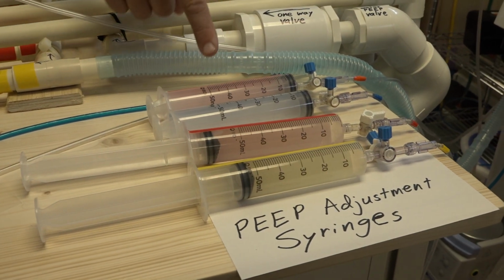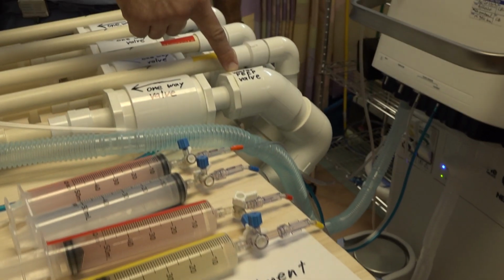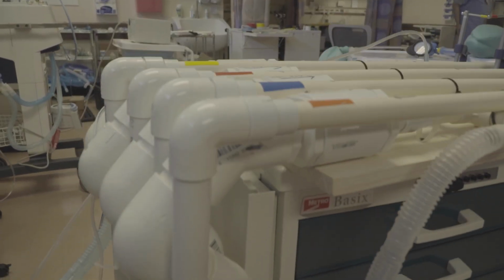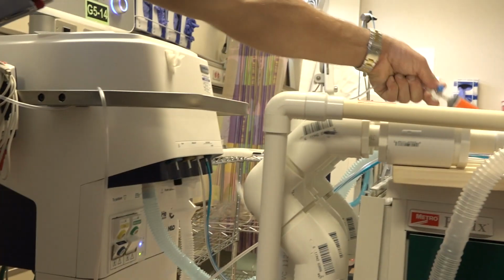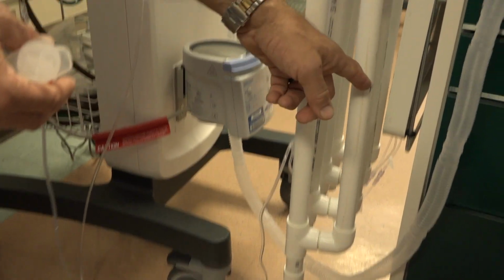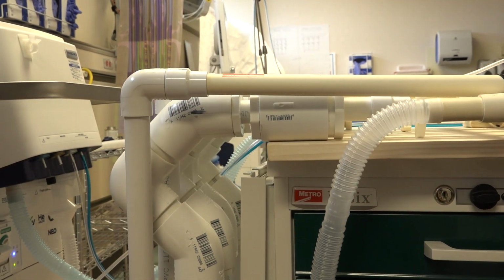So you'll notice we have some syringes here. They're different colors, indicating different patients. These syringes are then attached to our water PEEP valve located right here. And you can see over here, we have our expiratory flow going down this way, and water can be added with this syringe here to your desired PEEP. Then it comes out this way. This is our splash chamber here, and then going up to our 3D printed one-way valve there.